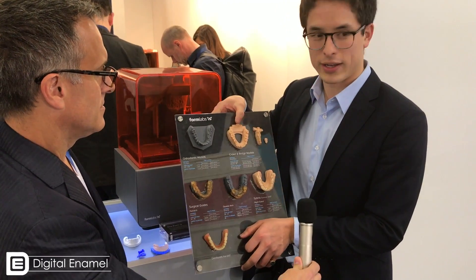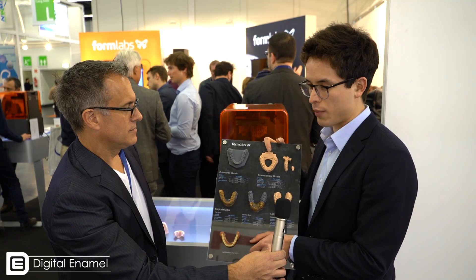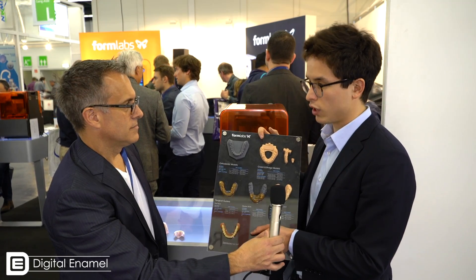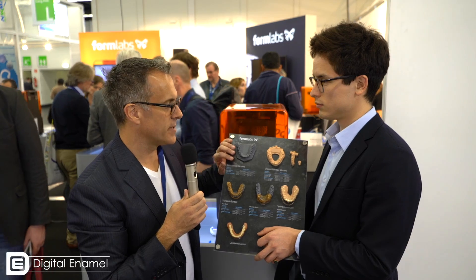These are the different types of resins. We're really excited about the new model material that we brought to IDS this year. This is a high-accuracy resin for crown and bridge model applications, and we've pushed much further in terms of accuracy and precision using the same printing system. It's got accuracy comparable to $75,000 3D printers. One of the things about the Formlabs printer is the laser spot size is 140 microns — maybe you could tell dentists how this is more accurate than that.